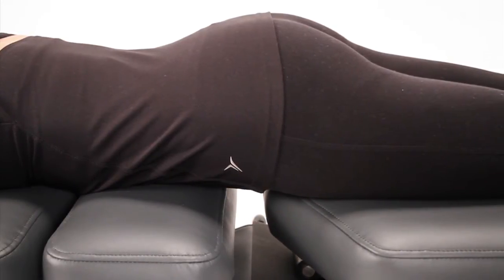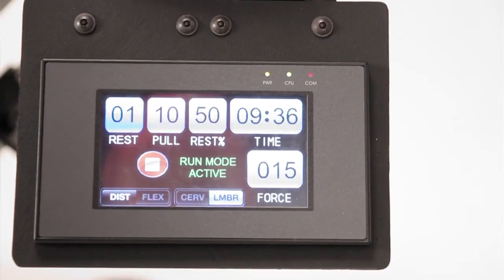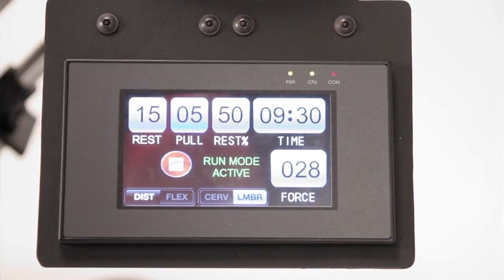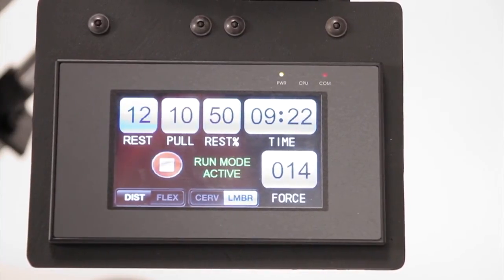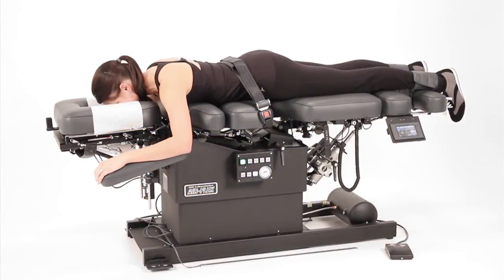During a treatment, all of the settings on the touchscreen will display actual values in real time, so you can monitor what is happening when it is happening. For first-time patients, it is suggested to use manual mode to distract and palpate your patient to determine the right amount of force needed. Pressing the Run button from there will use the desired amount of force as the maximum setting.